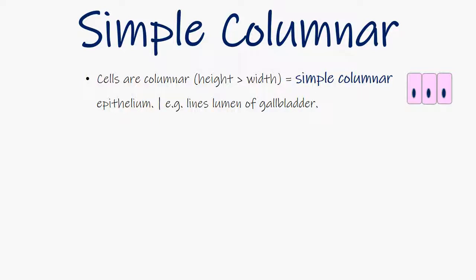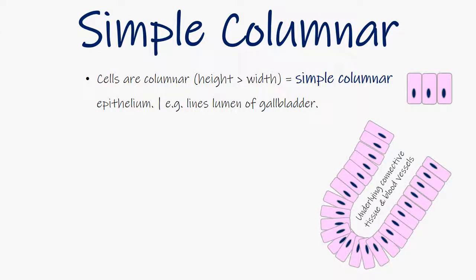Finally, for simple epithelium, let's take a look at an example of how we assemble simple columnar epithelia into structures. Simple columnar epithelium is found in a number of different locations, and one example is lining the gallbladder. Once again, you can imagine that we need to assemble each columnar cell into a structure as shown in this schematic. However, this time in the example of a gallbladder with a lumen on the outside. This example is not showing a circular structure like the previous slides, but is showing the absorptive columnar epithelial cells of the gallbladder projecting into the lumen of the organ.